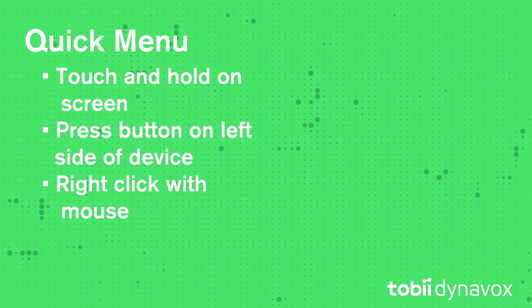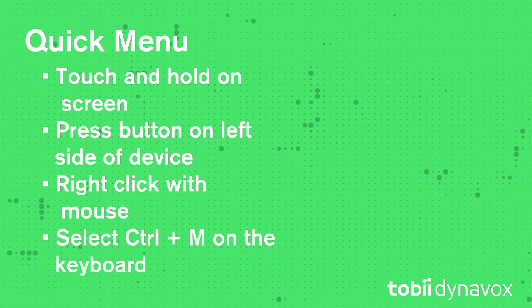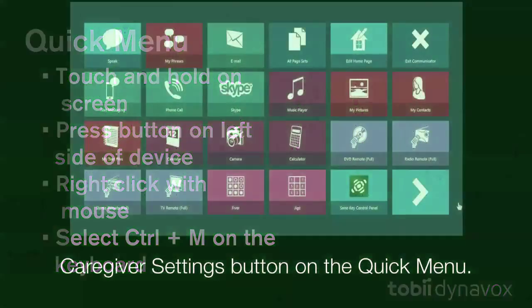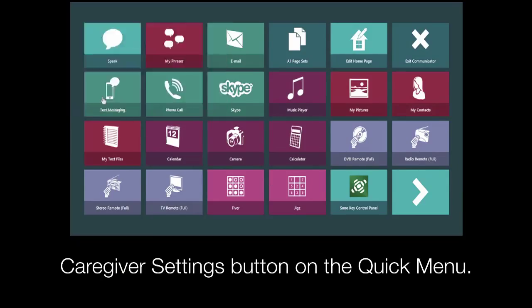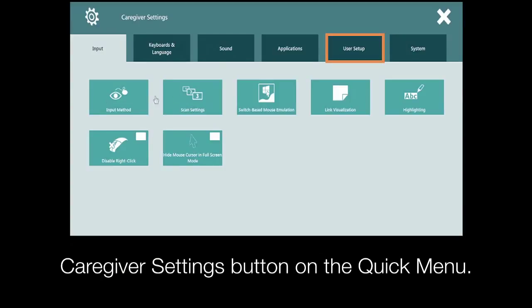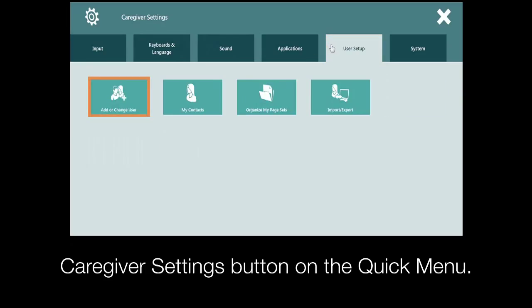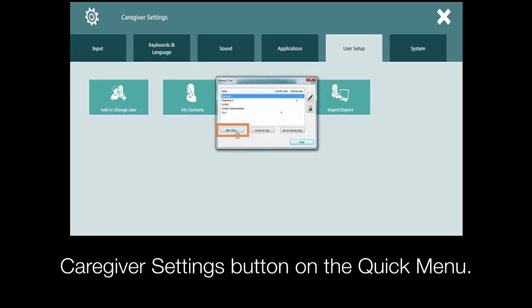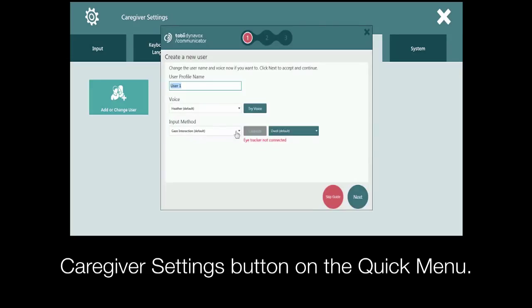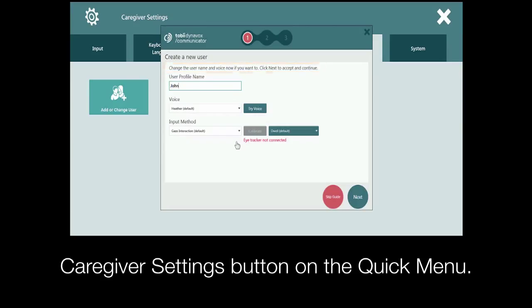You can right-click if you're using a mouse, or select Ctrl-M on the keyboard. Select Caregiver Settings and then select the User Setup tab. Select Add or Change User and then New User. This will launch the Getting Started Guide. Simply follow the prompts on the screen to begin the process of creating a new user.